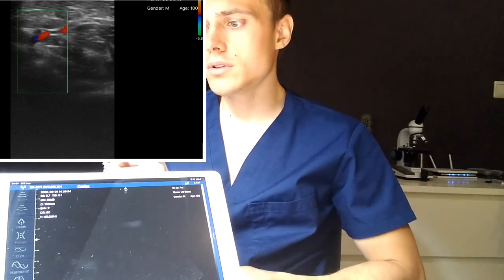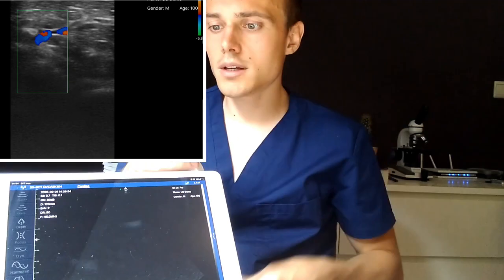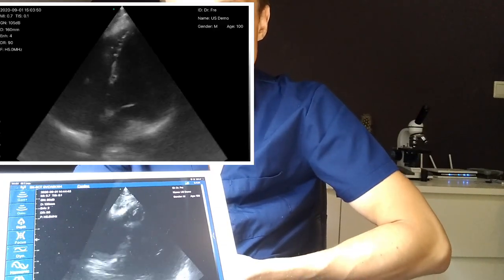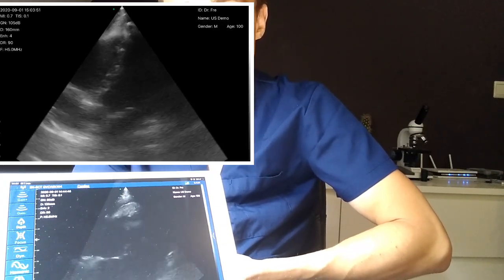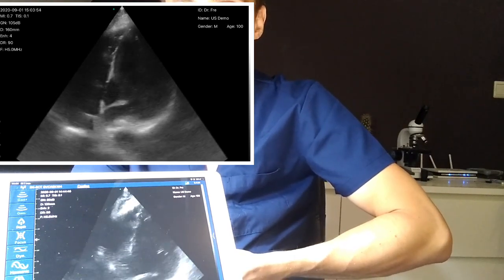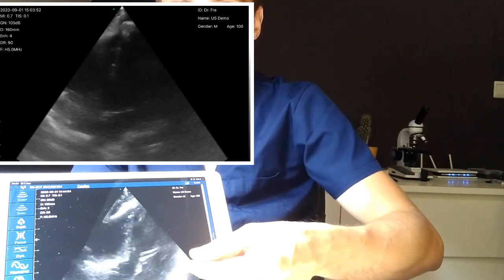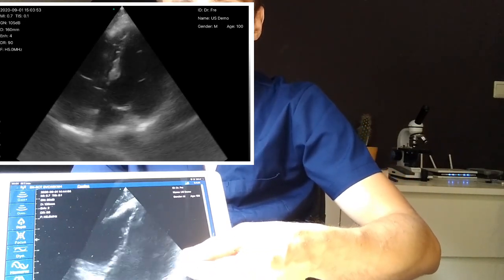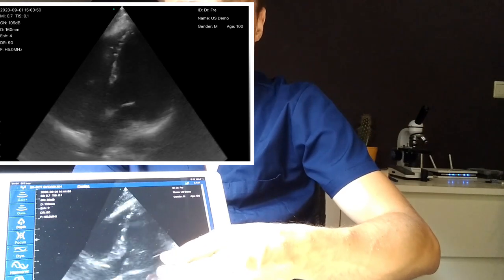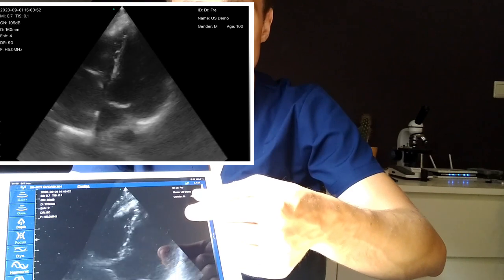We have the app running here, there's some gel on the probe. We're going to image the heart. As you can see we have the heart there — trying to get the parasternal short axis. We can see the mitral valve, we can see the outflow tract, we can see the right ventricle. I'm going to try to store some clips.